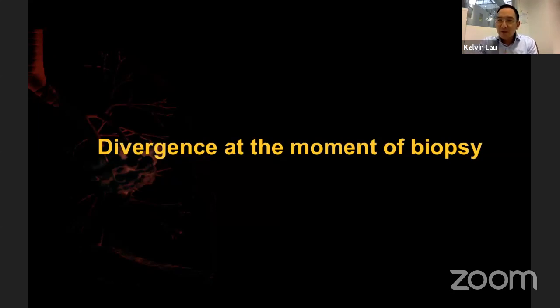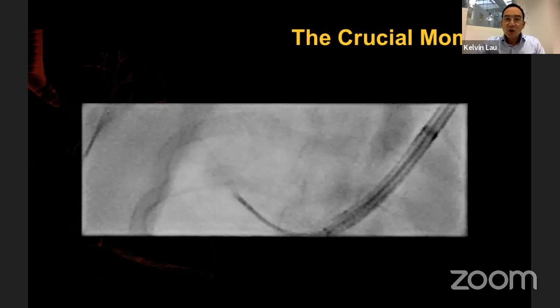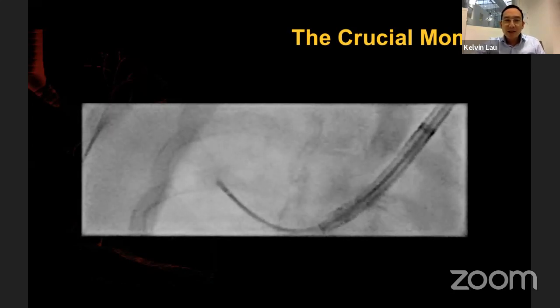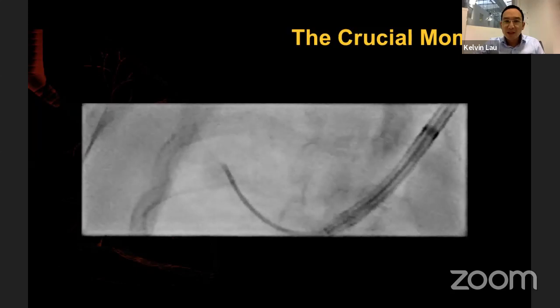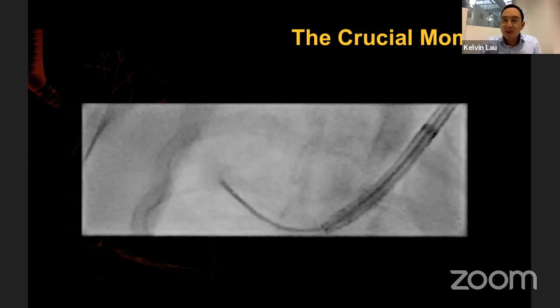The next problem you have is, where is your tip? Because at the moment, what we do is, once you've decided where you are, you take your locatable guide out and you biopsy. Well, that's a bit like flying a plane with your autopilot and then switching off your autopilot just as you land, and you can't see out your windscreen. Well, you wouldn't do that if you're flying a plane. So why would you take out your GPS just at the moment you want to biopsy, which is the most crucial moment of the whole procedure? If you look at the biopsy instrument here, can you see the wide trajectory of movement of this? Look at that. You need to know exactly where your biopsy forceps are at the moment of your biopsy.